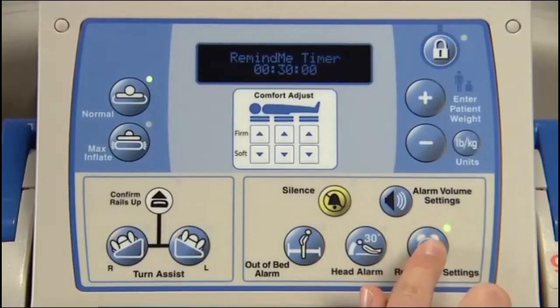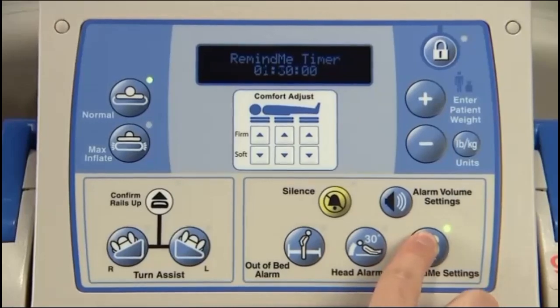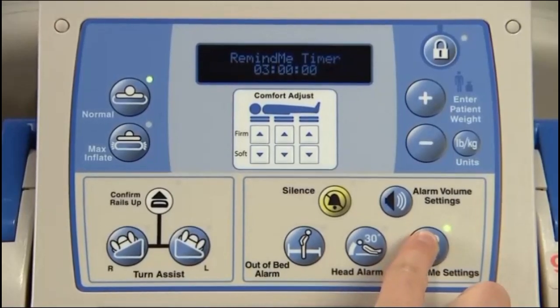The Remind Me Settings button is used to alarm various intervals for routine patient care tasks. Alarms can be set in 30-minute increments for up to 4-hour intervals.